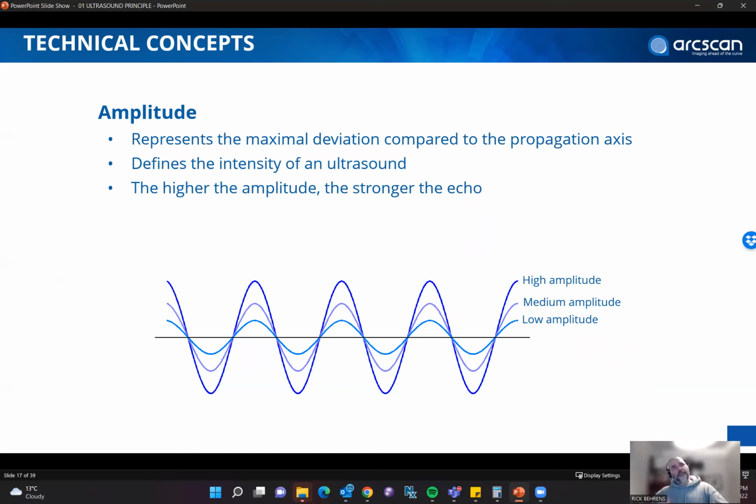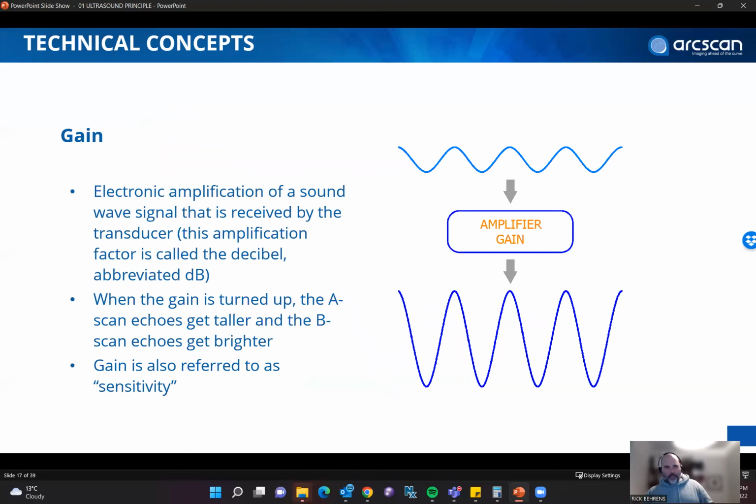But when you see the anterior chamber, it's black because there is no reflectivity. There is no echogenicity; the echogenicity of the aqueous is zero. It doesn't bounce back. If there is echogenicity in the vitreous, there is probably an infection, blood, or pus, there will be something there. So the amplitude is how bright it is, how much reflection a tissue will give you.